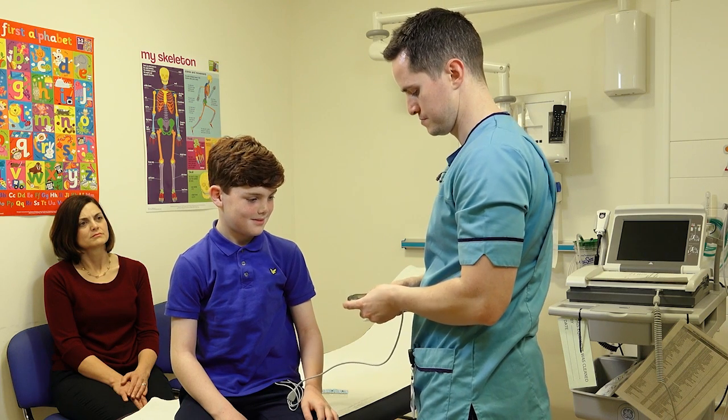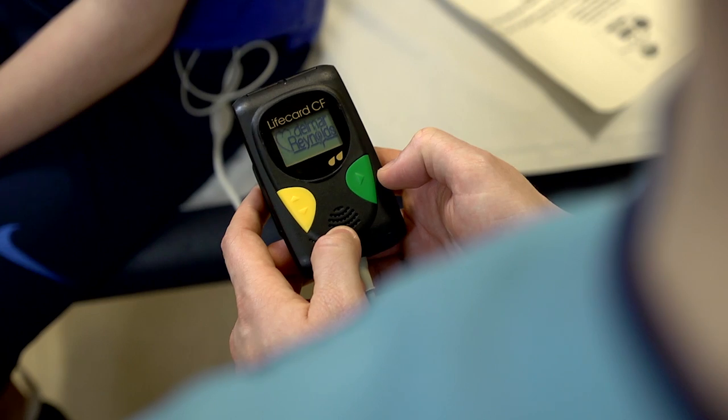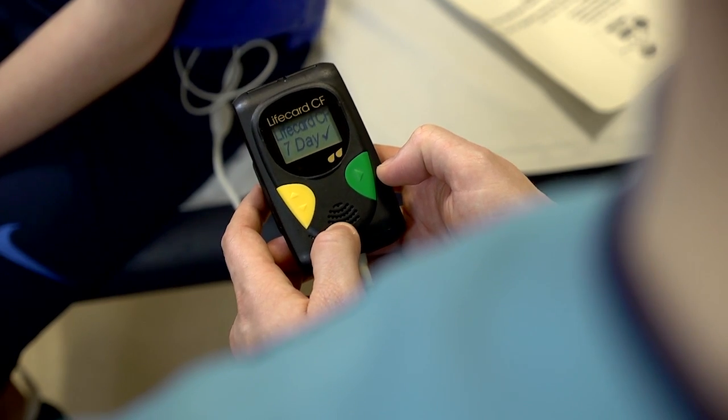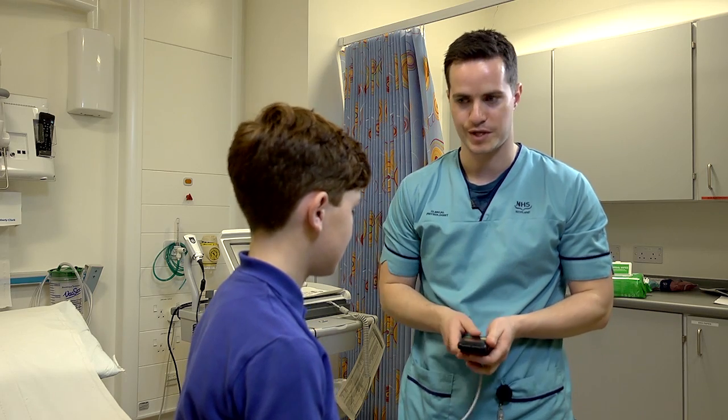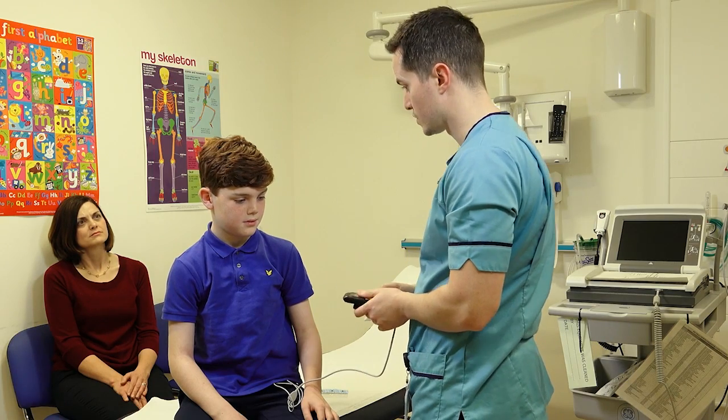So what we do now is connect it up here. You don't need to worry, it's not going to make any noise or beep at you. This is just for the initial setup. Okay, so that's the recording starting now.